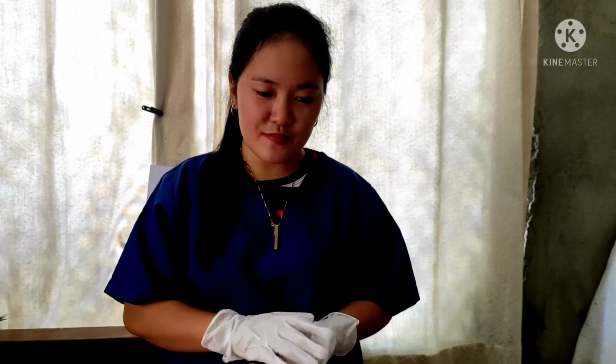Assess the patient's response to oxygen and comfort level. Anxiety increases the demand for oxygen. Dispose of gloves if you wear them and perform hand hygiene to prevent spread of infection.